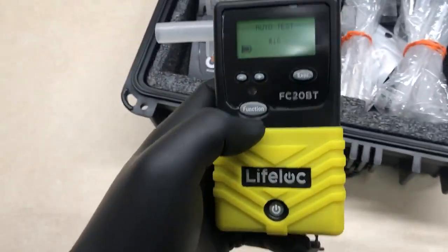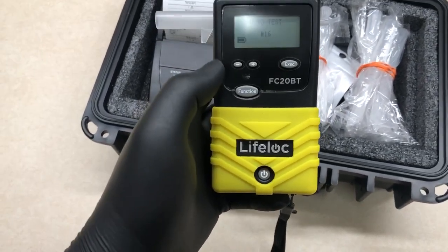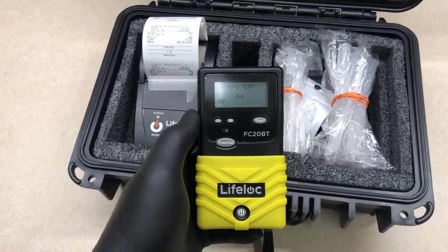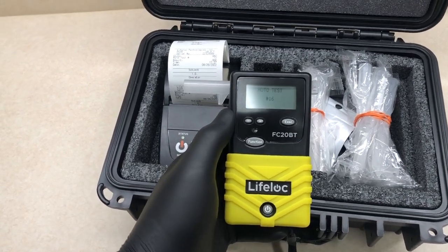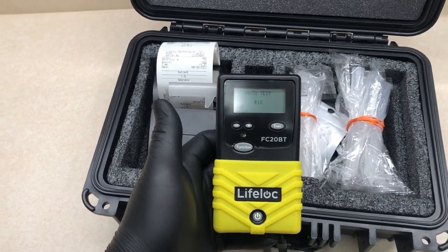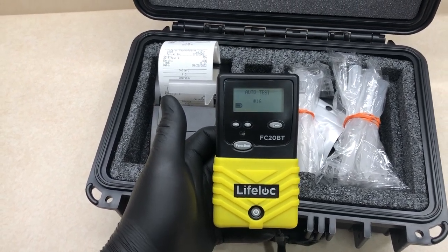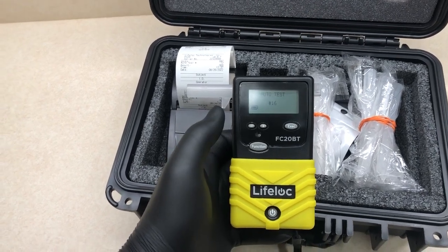Now we're going to go over what happens whenever we test in manual mode. The manual mode would be for patients that are kind of short of breath, or patients that don't really want you to find out what their blood alcohol concentration is. They're the ones that give you like the little puff of air, and it doesn't register on our other one, the auto test.